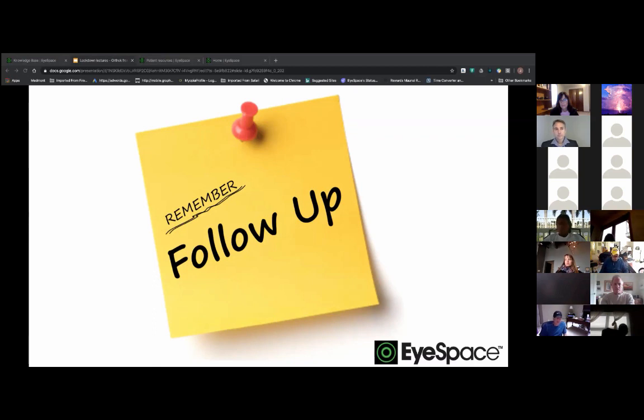Charl, just so you can be a purist, what would be the counter to that? I actually do not have a counter. I'm actually a firm believer that people should take lenses out in the morning. And here's my take on this. When the patient wakes up in the morning and they start moving about, eventually that lens will come loose and it will start moving. Now, the way I always explain Ortho-K is you're making a jelly mold. So if you grab that jelly mold and you keep on moving it all over the cornea, it's going to affect the overall reshape. It's going to influence the shape as the patient walks.